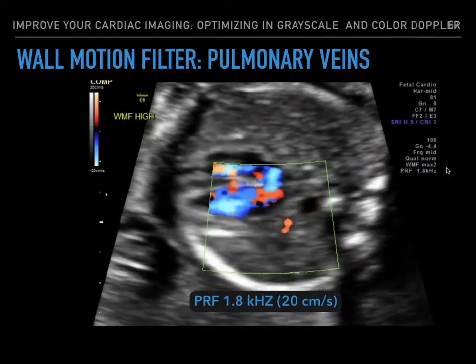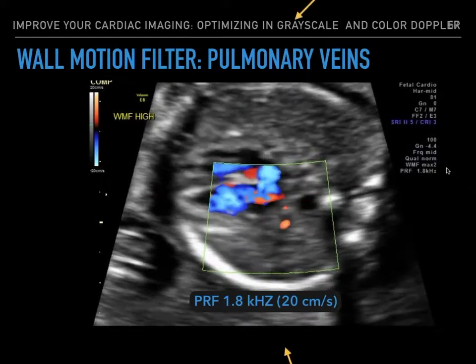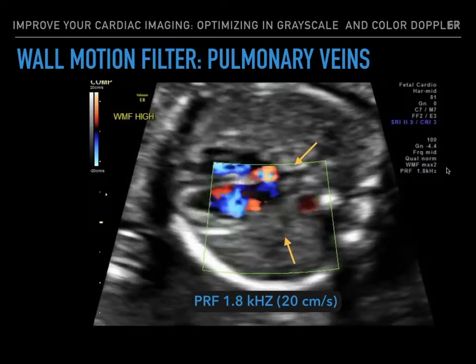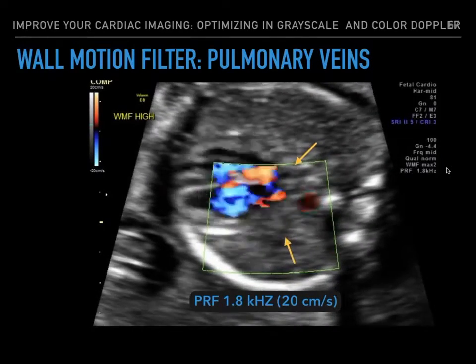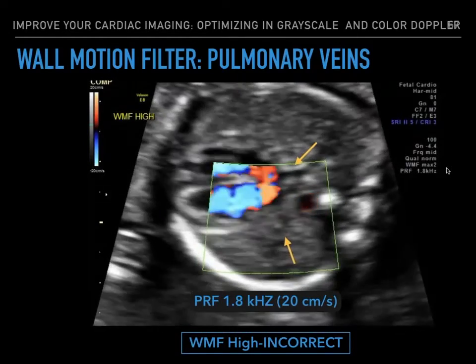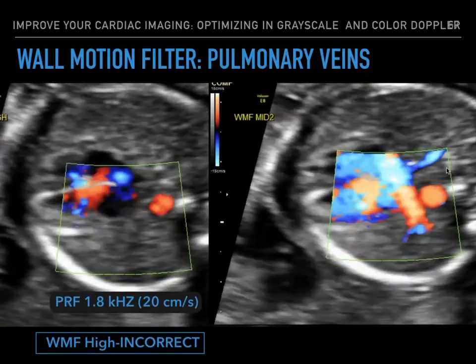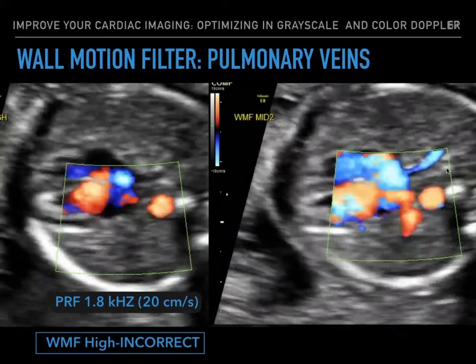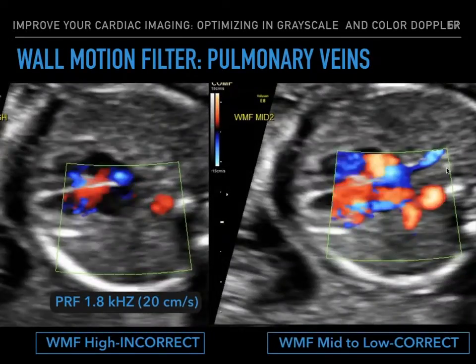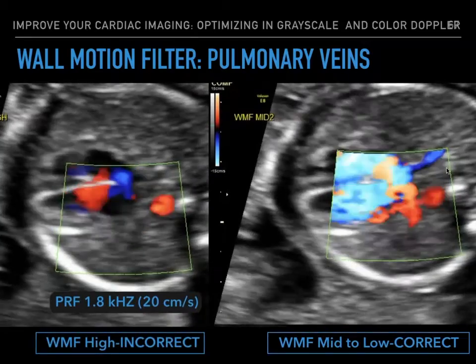Same with the pulmonary veins. Here we have our PRF scale set to low at 1.8 kilohertz, yet we are not seeing the pulmonary veins filling in. This is due to an incorrect wall motion filter set to high. So utilizing a mid to low wall motion filter setting is actually appropriate to evaluating the pulmonary veins. And here you can see the pulmonary veins draining in nicely into the left atrium.